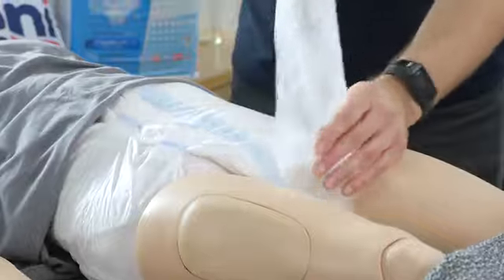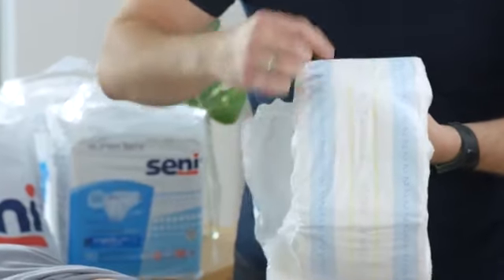In addition, these products have a special EDS distribution layer, which will perfectly distribute moisture throughout the entire surface of the product. Thanks to this, we use the absorbency we paid for. In addition, the product has a wetness indicator that indicates the need to replace the product. It is a perfect solution both for the patient, because we change the product exactly when it is needed, but also for the caregiver, because the product is not changed too often, and of course, not too rarely.